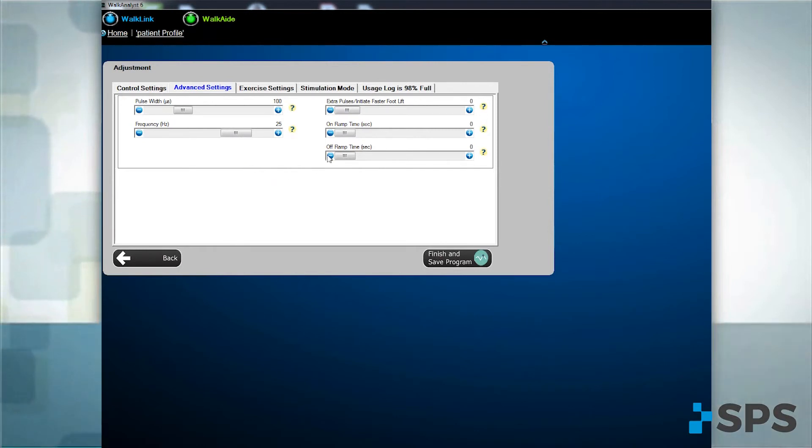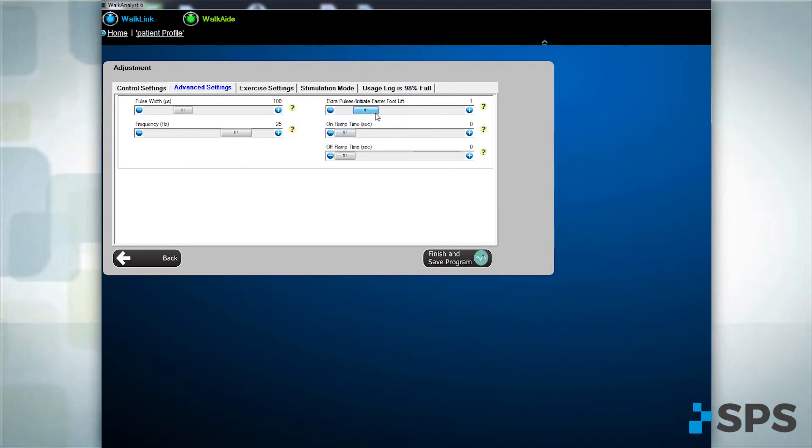Add extra stimuli to encourage a more immediate response to the stimulation. For example, delayed response due to multiple sclerosis.